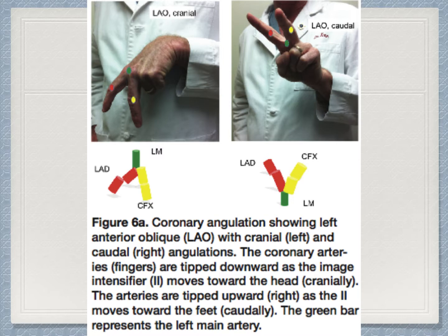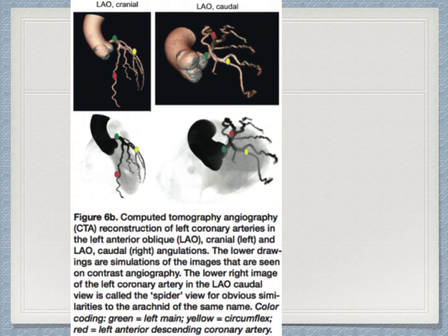Then, I'm going to associate this with thinking with the head. If you think with your brain, cranial, probably you will be able to control what's down below, so it points down below. If you think with what is caudal, the inferior thing, it will be going up. That's why the peace sign will be going up. So here is the same projection with reconstruction of CT scanning.